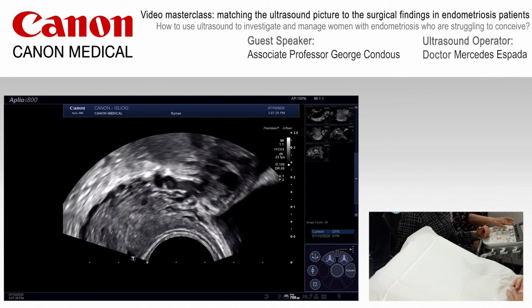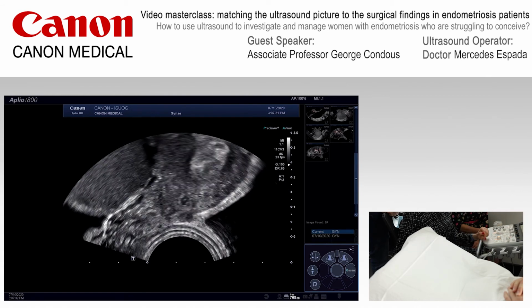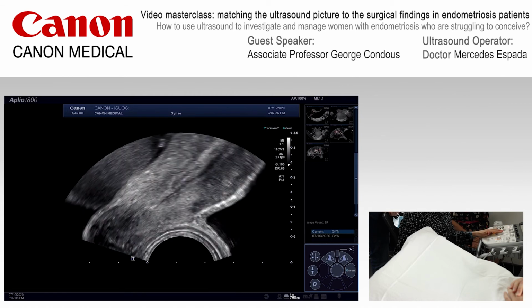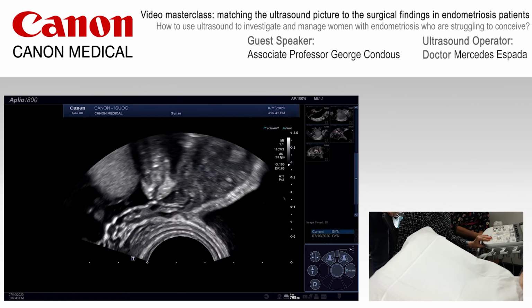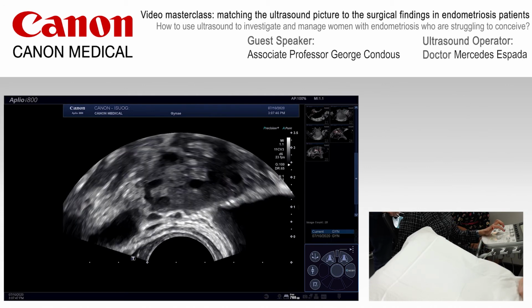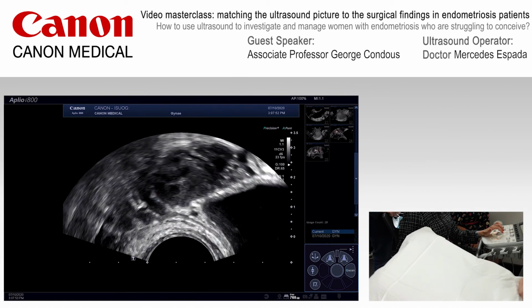We've got the probe in the anterior fornix, and as we swing to the right, we can see coming into play beautifully the right ureter. So we'll put an arrow onto that, and you'll see quite clearly in a minute with some patients. When you put color on, you can see that it's not vascular itself. And so I usually get patients to have a cup of tea or coffee an hour before the scan, so that even though the bladder's emptied before the scan, we get a good degree of vermiculation during the scan.